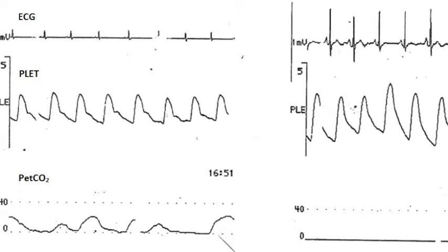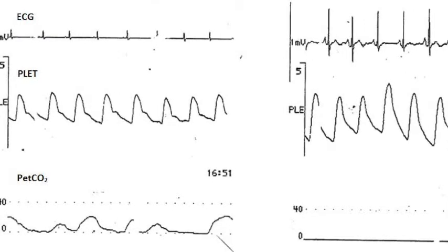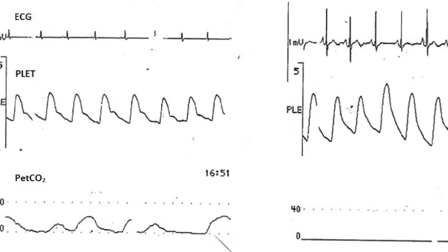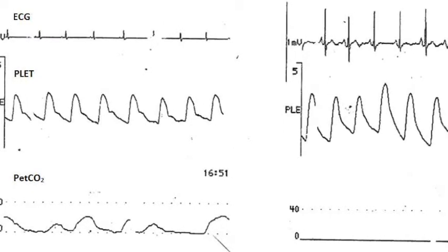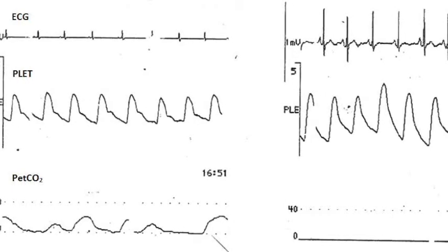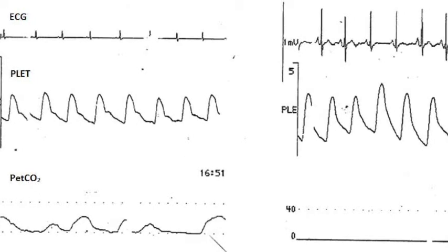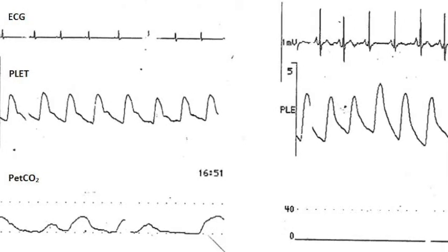Tel Aviv, Israel, describes 4 examples of respiratory obstruction related to plethysmographic waveform variation in his article published in this month's issue of Anesthesia and Analgesia titled Excessive Variations in the Plethysmographic Waveform During Spontaneous Ventilation, an Important Sign of Upper Airway Obstruction. First, the amount of variation resulting from upper airway obstruction was 2 to 3 times greater than the 9 to 15% variation that is typically found when fluid responsiveness is identified.